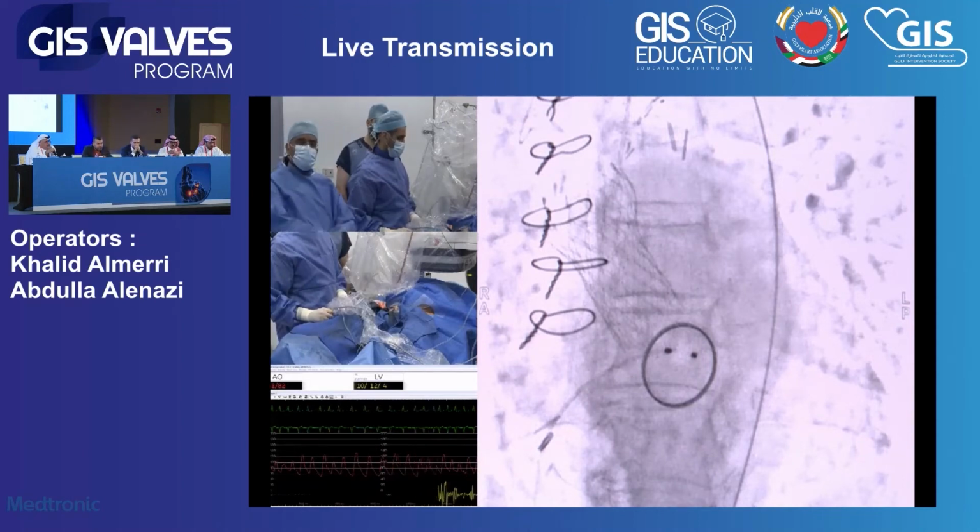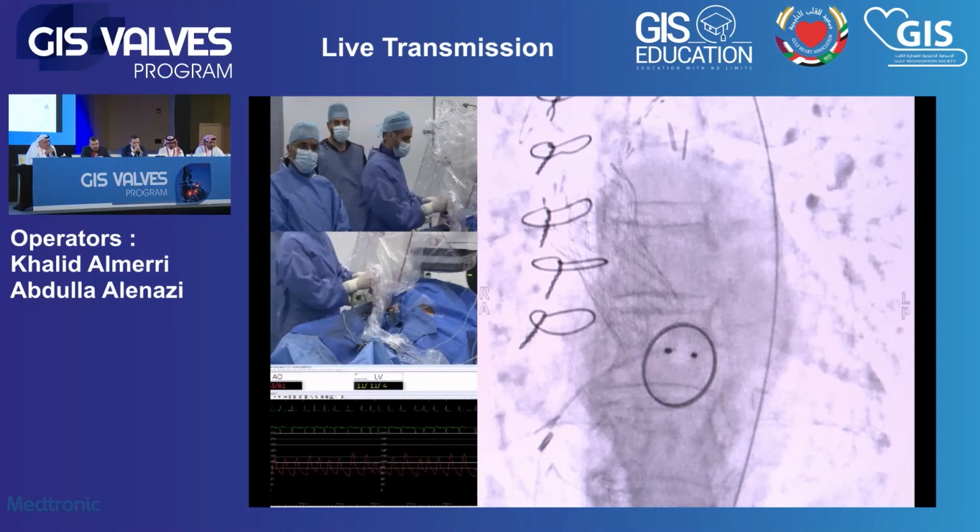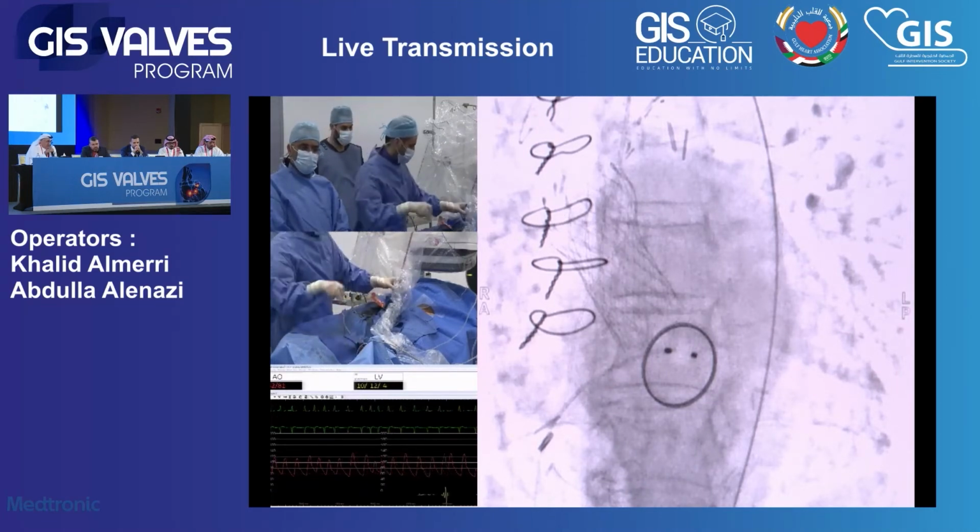Right. So Khalid, back to you. This patient is anticoagulated. He has a mechanical valve in the mitral position, the St. Jude valve. Did you have any special approach regarding the anticoagulation and antiplatelet therapy? What is your plan there?